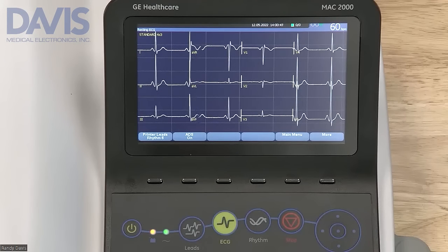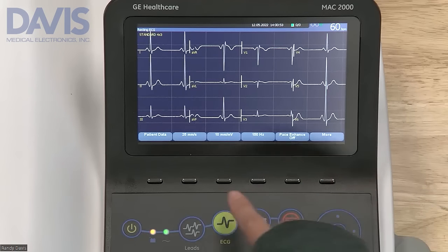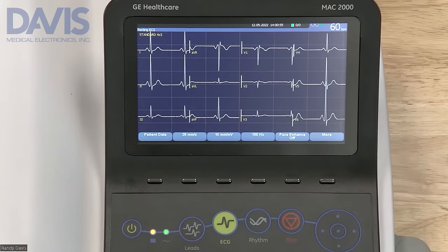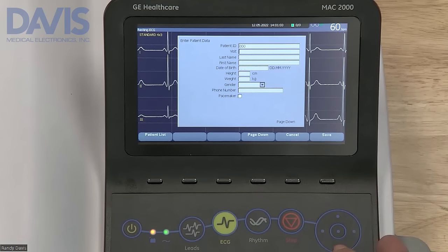To take a resting ECG, first hook up your patient. Use the soft keys to scroll through the different options until you see patient data. A window will pop up to prompt you to enter in patient demographics. This option is configurable on the settings menu.